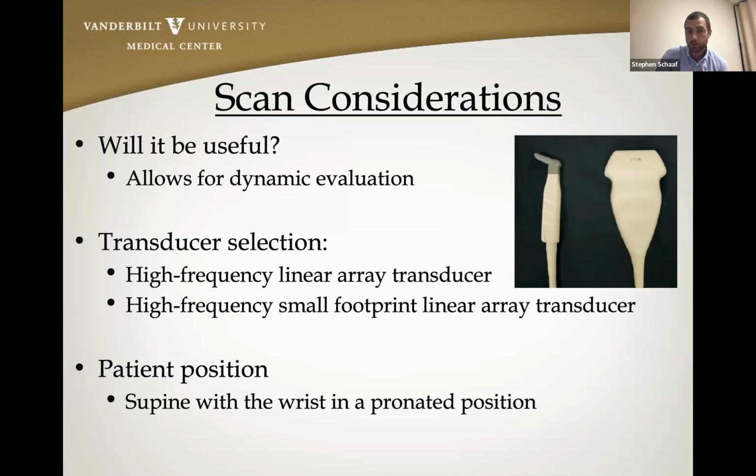And then typically for positioning for these patients, I'm just going to have them lying supine on the bed with the wrist in a pronated position.